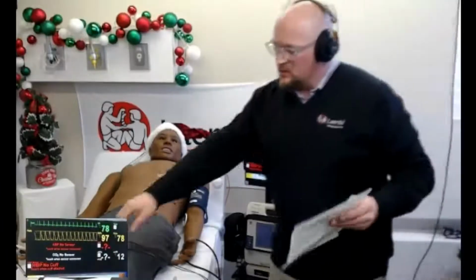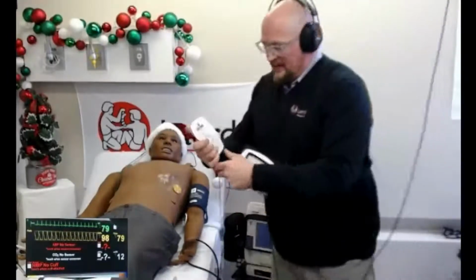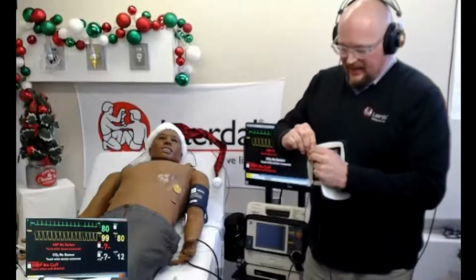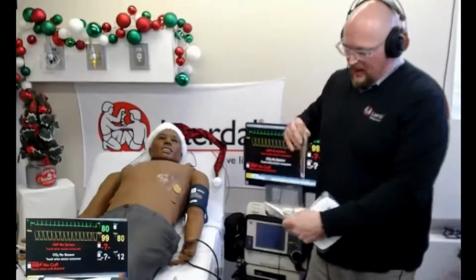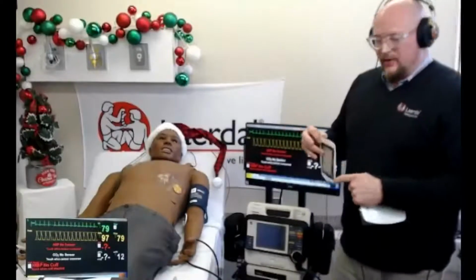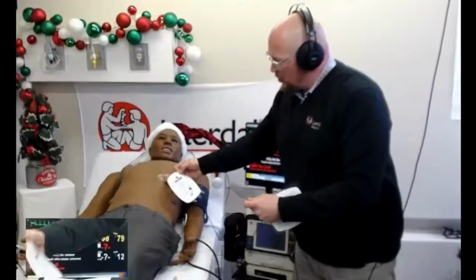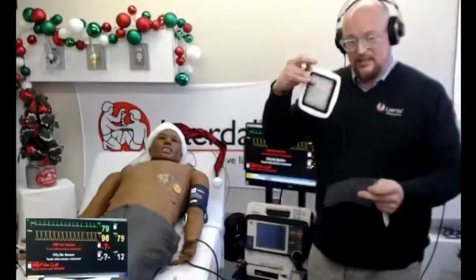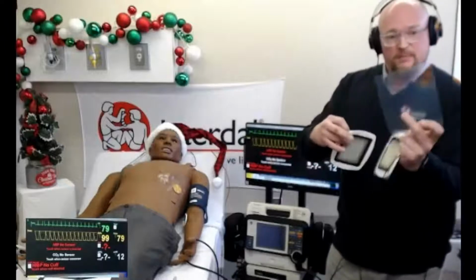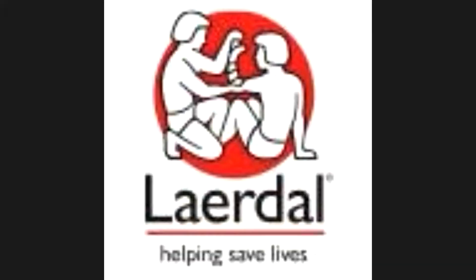And the cool thing is, once you start to peel back these defibrillation pads, with these ones for sure, they come with a nice little sticky back. So when I want to shock them once and then leave that scenario and use these again, I can just take the silicone dressings, which will stick to this once I stick this on. That's going to take it with it, and it gives you some backing to put all this back on once you're finished.